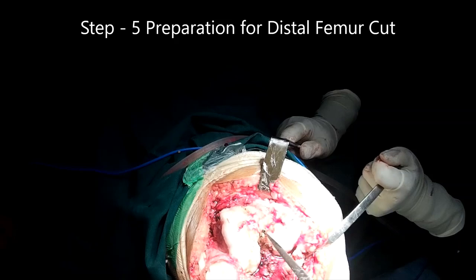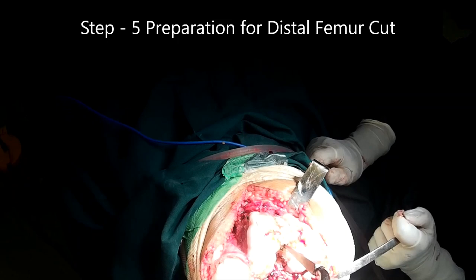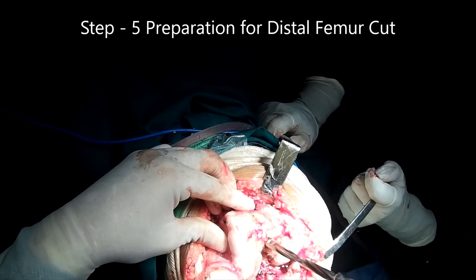Now we mark the entry point for femoral intramedullary alignment rod. The entry point should be slightly anterior to the insertion of the posterior cruciate ligament.